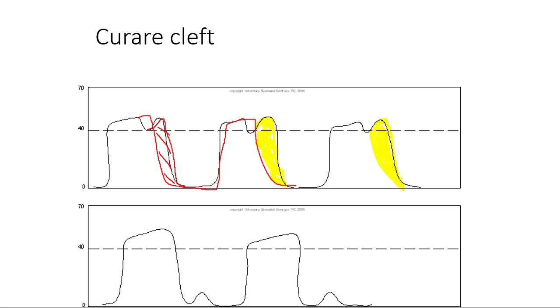This tells you your sedation may not be strong enough, and I would consider redosing. Here's another example. Now, this one isn't necessarily in synchrony with your breath. But what you have here are some spontaneous respiration attempts. They're not full, they're not great, but they're a clue that your sedation and paralysis is wearing off.